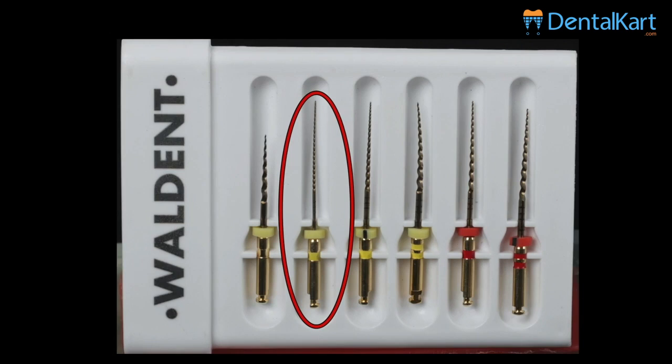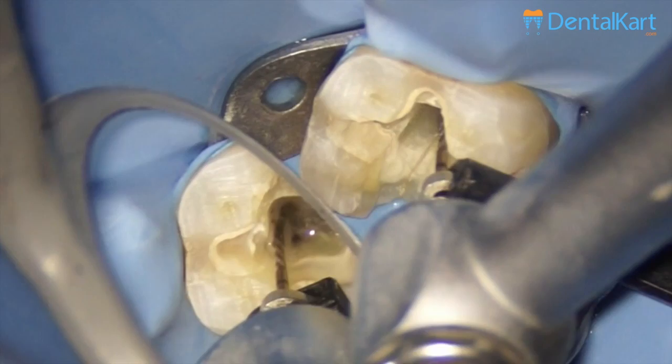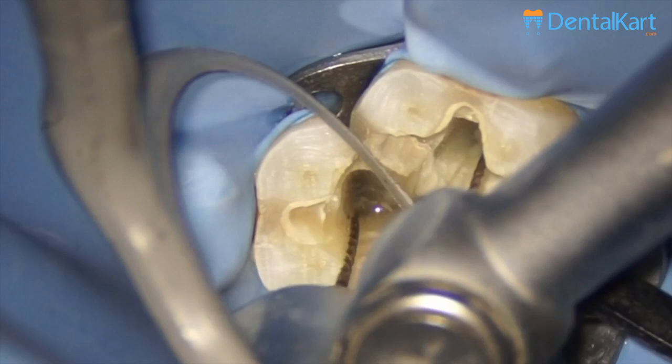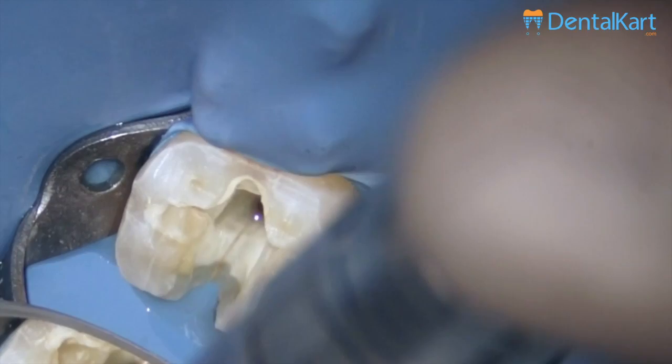The next file we are going to use is the glide path rotary glide path file, which is a 19/2% file. Since we do not use manual K-files for working length determination, I have attached the apex locator's file holder to the rotary file so we can determine working length and also have adequate length control during rotary instrumentation. This is not an integrated endomotor with apex locator — here an independent apex locator is connected to the endomotor during rotation. After each step we are going to do a lot of irrigation and agitation, which we will not be showing repeatedly.